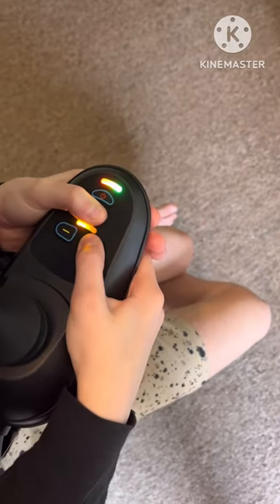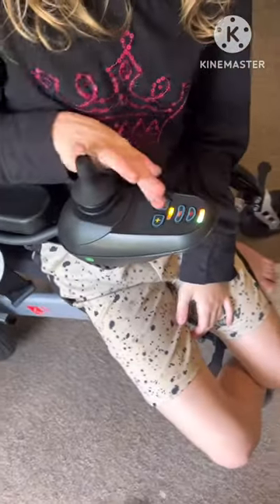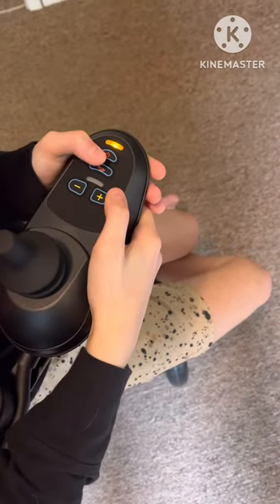Hit the horn button again, then go backwards — and there's the terrible noise again. So let's disable it one more time: horn and positive, then horn button again.